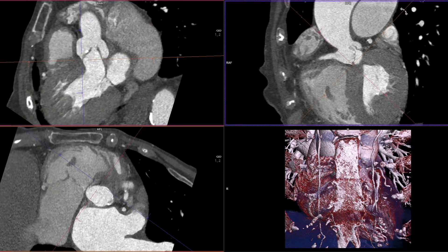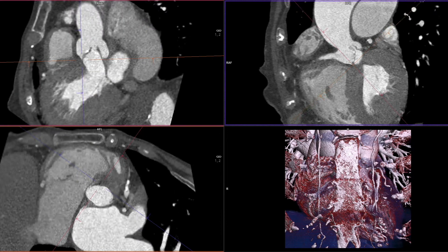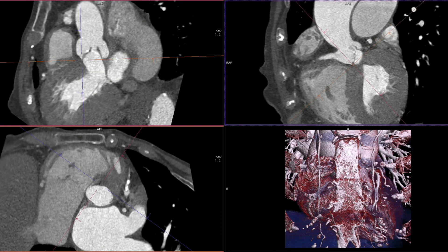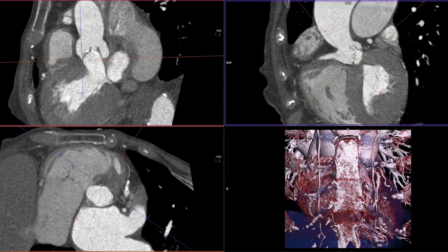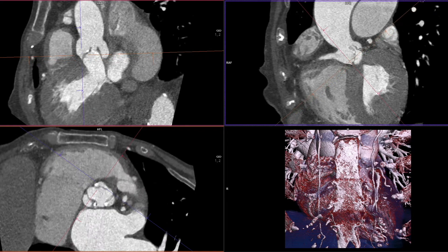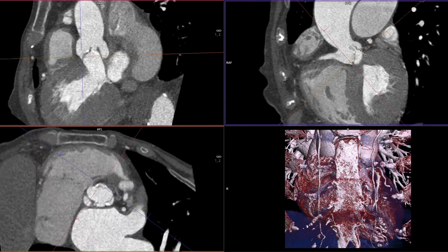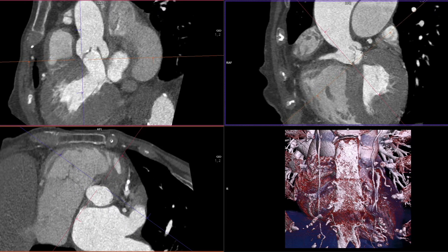We can verify the result by moving the orange reference line carefully up and down in the upper right-hand image. Now the orange line represents the aortic annulus plane and therefore the upper end of the membranous septum.